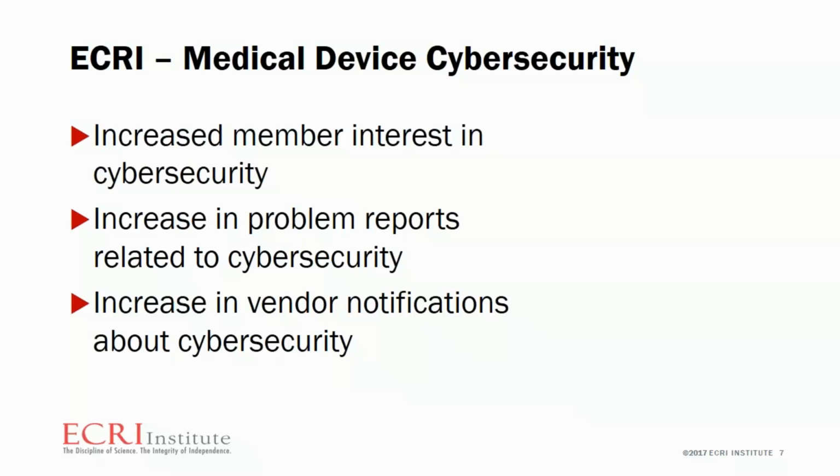And finally, we've also seen a wave of vendor notifications about cybersecurity. Really, over the past 2 years, there's definitely a lot of vendors who've become more transparent about security of their products. Vendors are sending out field correction notices about vulnerabilities that exist within their product, as well as providing mitigations on how to address that.